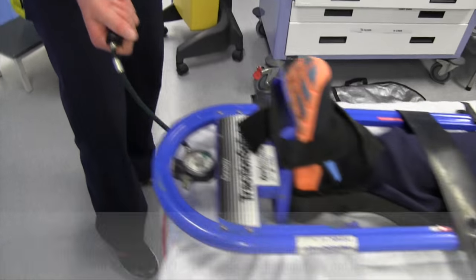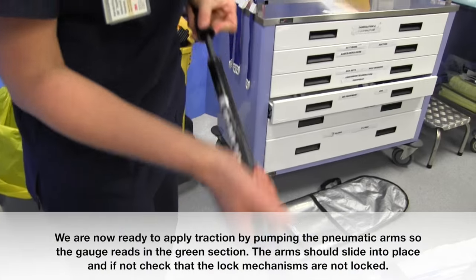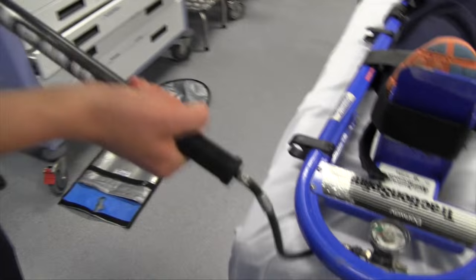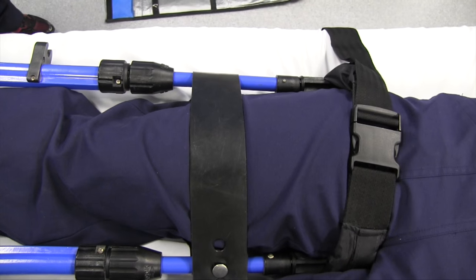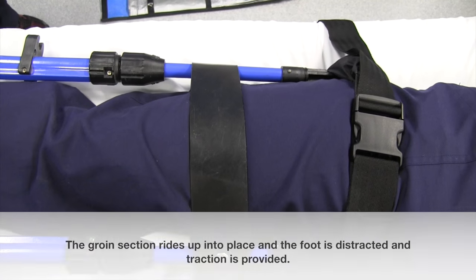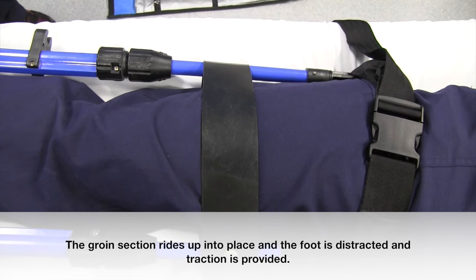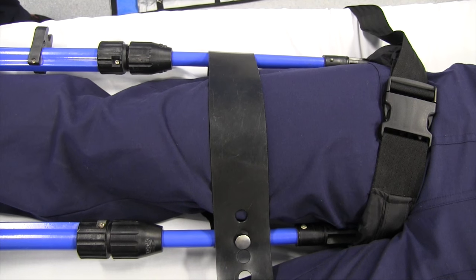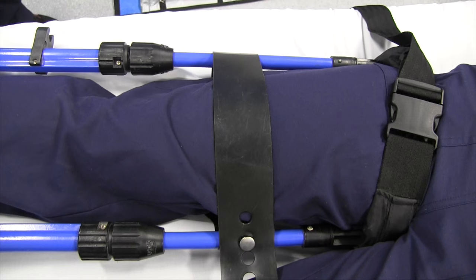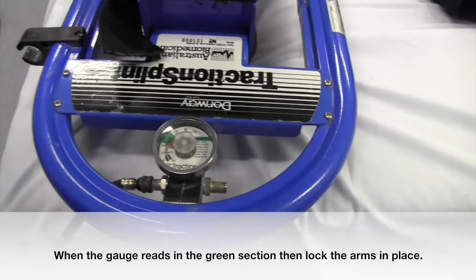We are now ready to apply traction by pumping the pneumatic arms so the gauge reads in the green section. The arms should slide into place, and if not, just check that the lock mechanisms are not locked on. The groin section rides up into place and the foot is distracted and traction is provided. When the gauge reads in the green section, lock the arms in place.